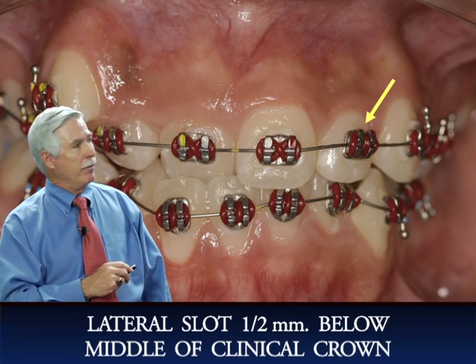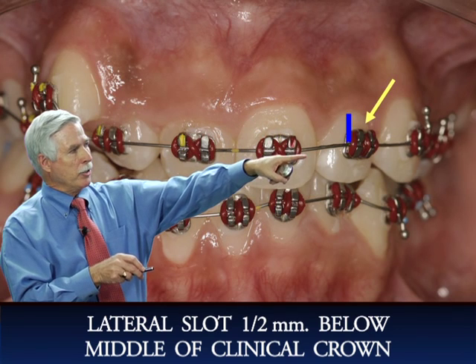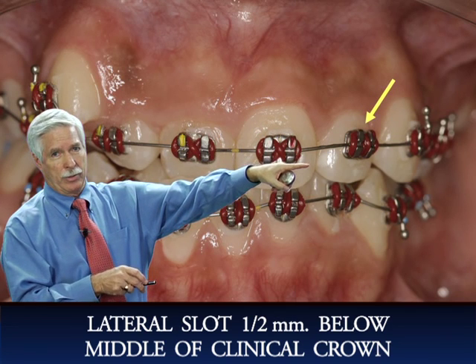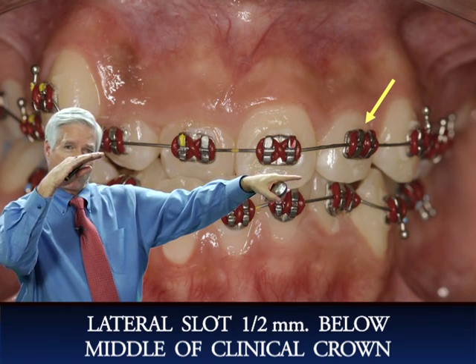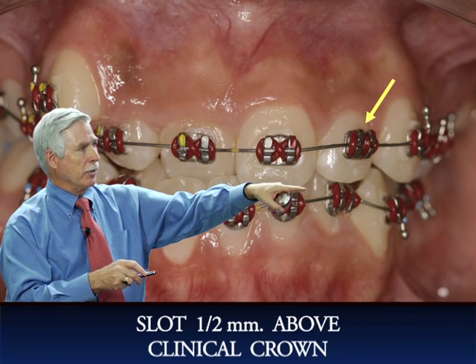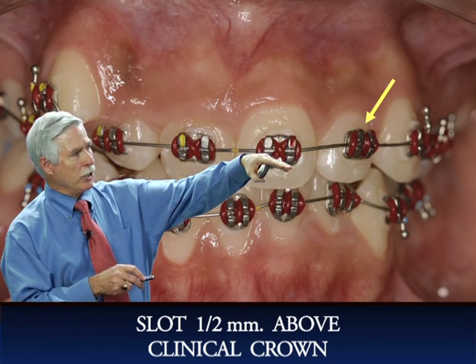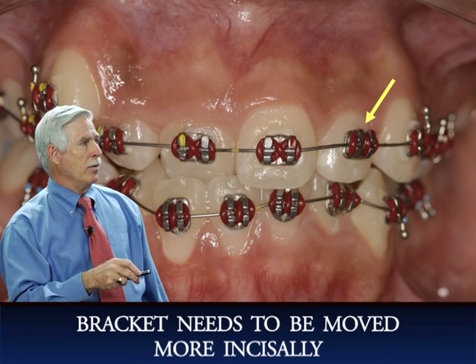Now the lateral incisor, however, I don't think we placed it correctly, because you can see if you measure from the gingival margin to the incisal edge, say that tooth is 9 millimeters long, the halfway point would be 4.5, then you drop the bracket 0.5 millimeter incisally, so you should have 4 millimeters from the incisal edge to the bracket slot, and you don't. So you can see plainly that that bracket on that upper left lateral incisor is too gingival and needs to be moved more incisally. So we'll have to see.